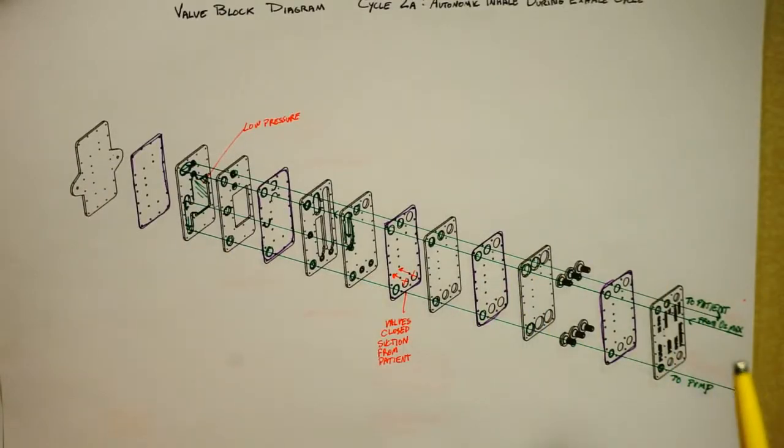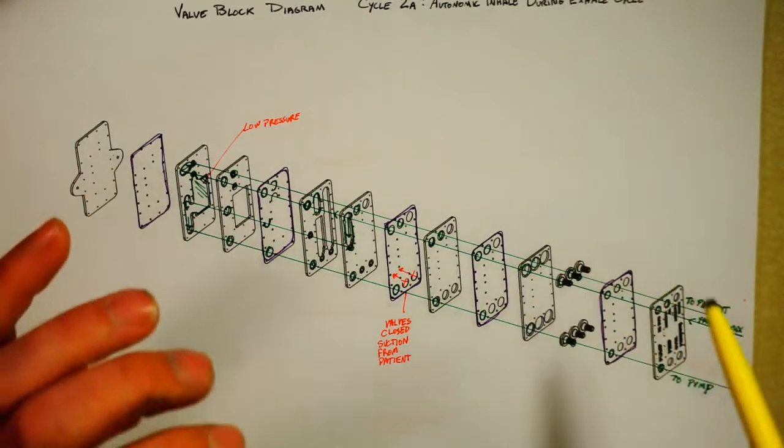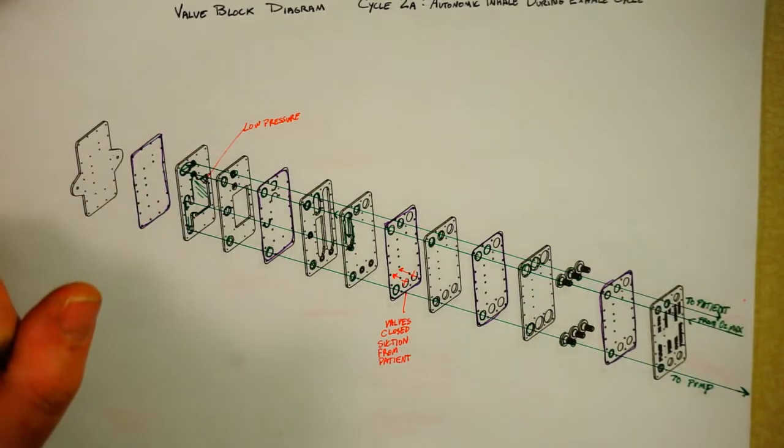Okay, so the next thing I want to do is take a look at the actual valve, disassemble it, and take a look at what it's doing in reality.